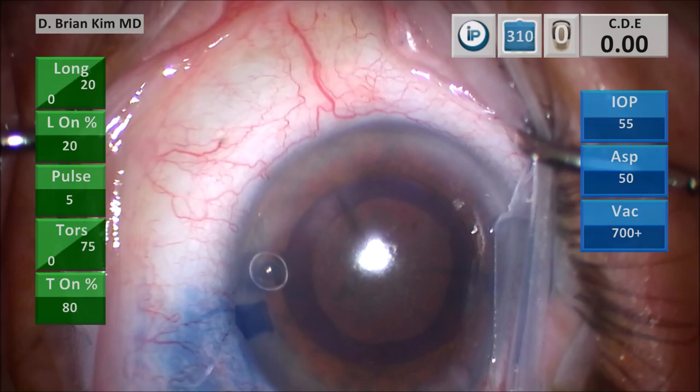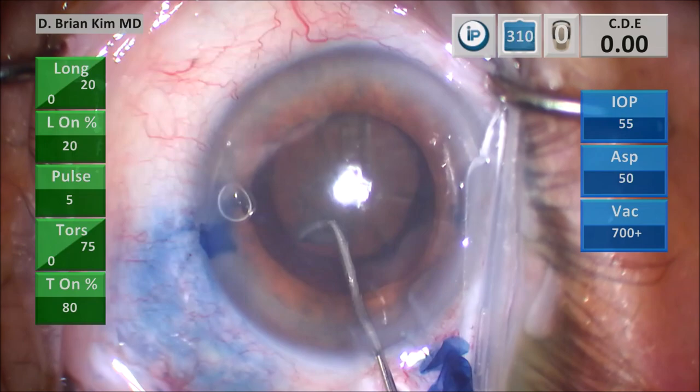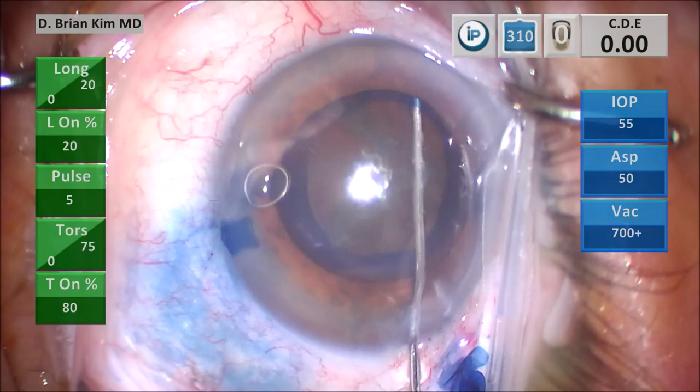This will be the capsular fornix hydrodissection technique. I place the cannula out to the equator contra-incisionally, point the tip down, get a nice fluid wave, and decompress on the left side. You can see the shininess of the lens, which does tell you it's a pretty dense, leathery lens. I turn the tip to the right side and it spins nicely.